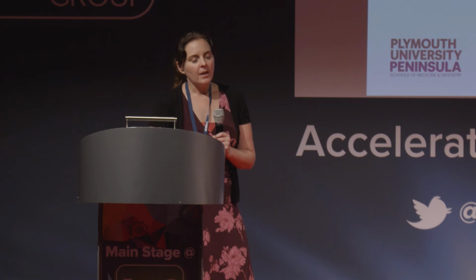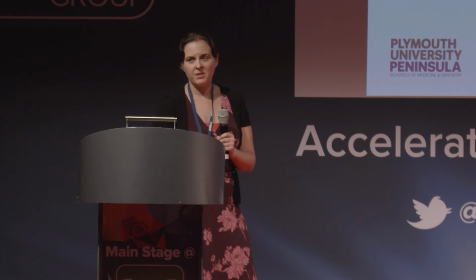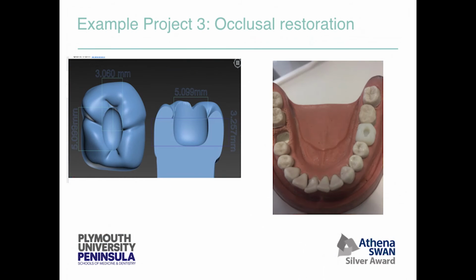We ended up with lots of holes in the teeth which perhaps weren't the right size or shape. There was a lot of variability. And again, in exam conditions, when we're testing our students on placing restorations, we want them all to sit the same exercise. So again, we 3D printed a tooth with known dimensions of a cavity and got them to fill it. This one is printed, again, I think on a Stratasys printer, but it was one of their models that was designed for use in clinical dentistry.